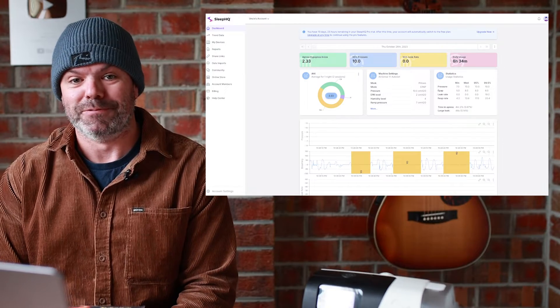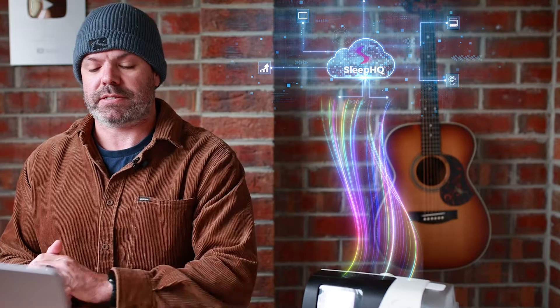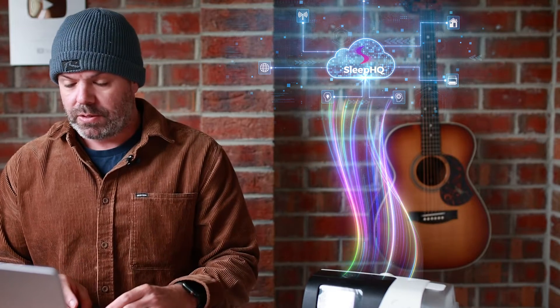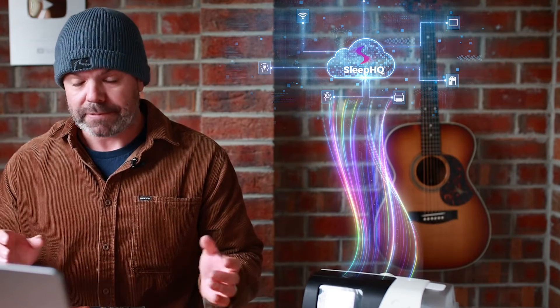That was a close call! Now that's a manual upload. If you like, we do have the Sleep HQ magic uploader, and this will automatically upload all your CPAP data — every breath you take — every 10 minutes, without you doing a thing.